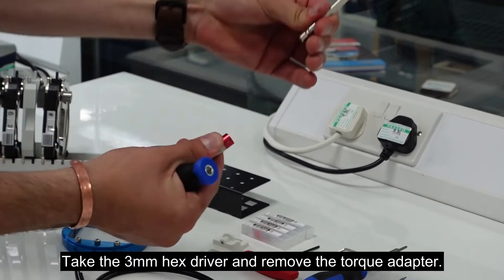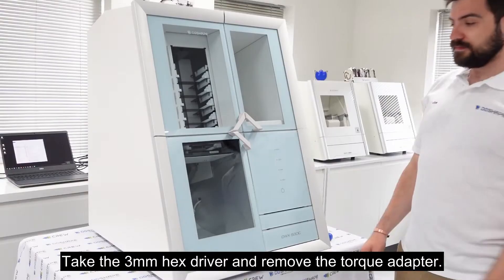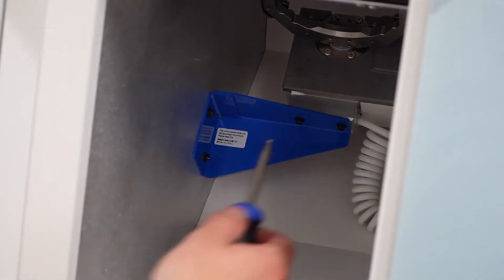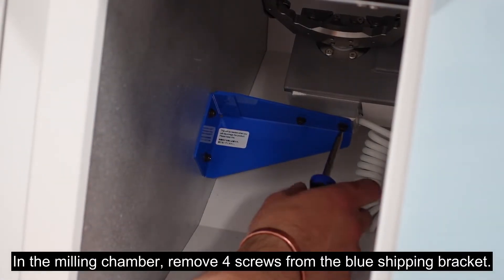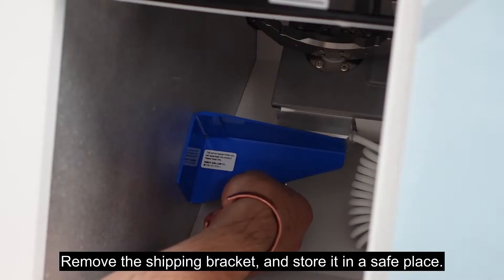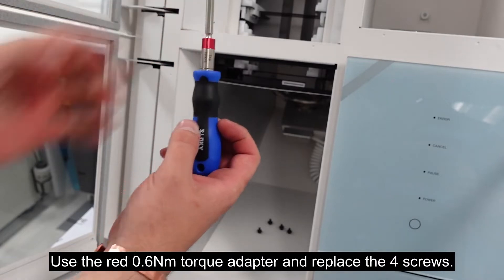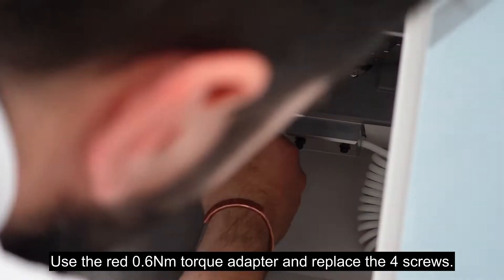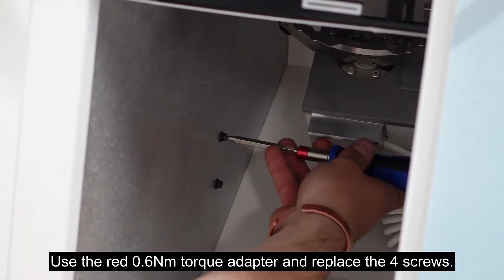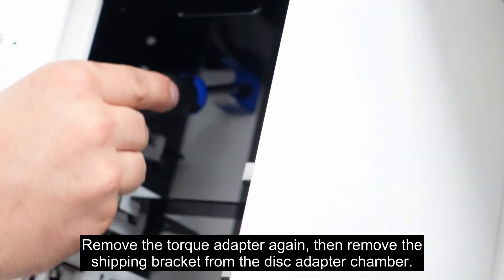Take the three millimetre hex driver and remove the torque adapter. In the milling chamber, remove four screws from the blue shipping bracket. Remove the shipping bracket and store it in a safe place. Use the red 0.6 Nm torque adapter and replace the four screws. Remove the torque adapter again, then remove the shipping bracket from the disc adapter chamber.